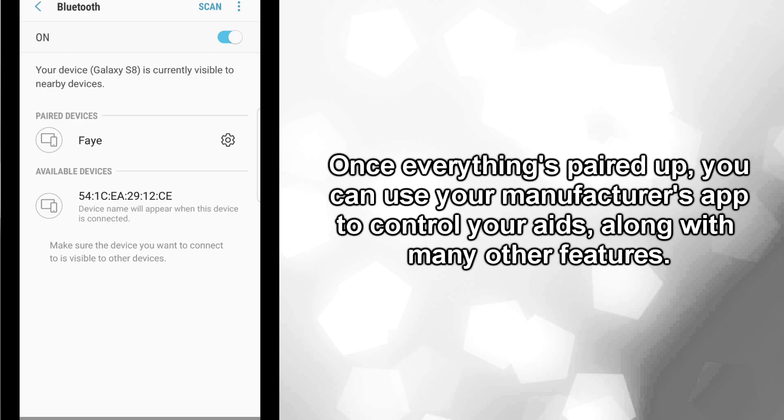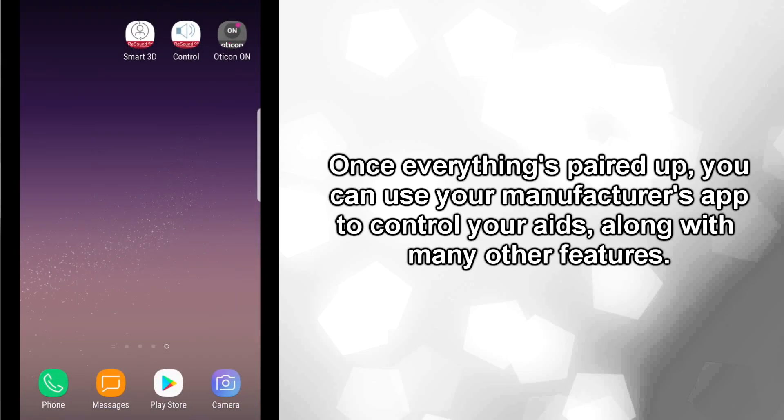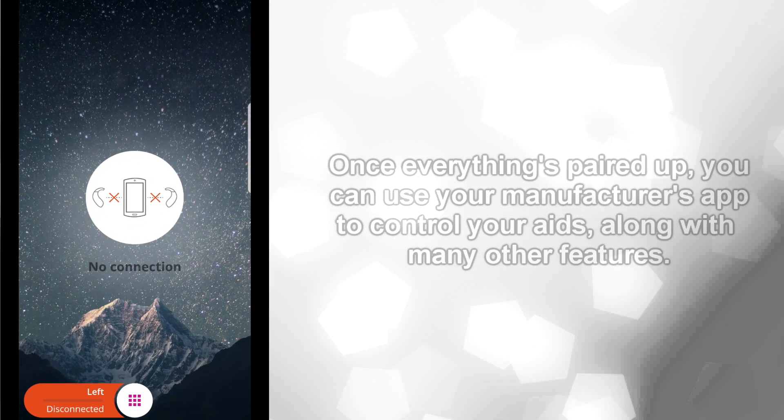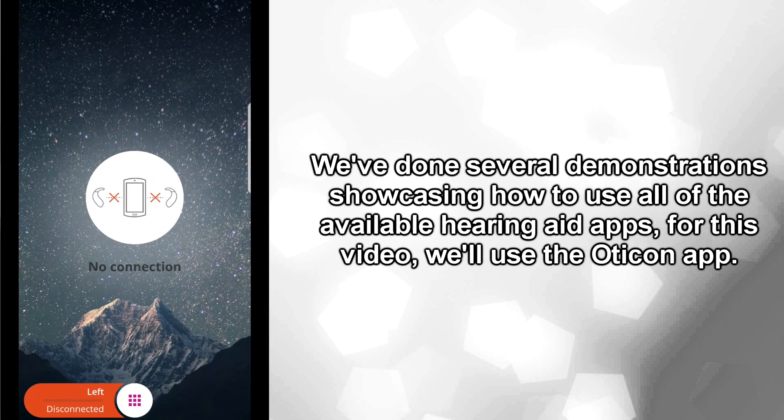Once everything's paired up, you can use your manufacturer's app to control your aids, along with many other features. We've done several demonstrations showcasing how to use all of the available hearing aid apps. For this video, we'll use the Oticon app.